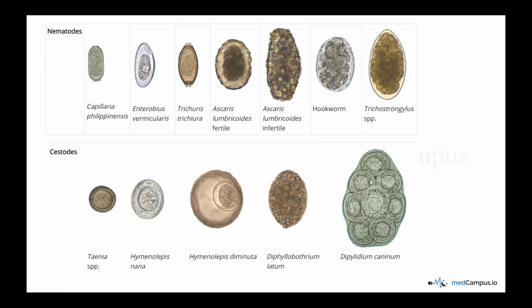And you might confuse this egg with the hookworm egg in the exam. Please, this operculum or lid structure helps you in differentiating it, and also the color. Hookworm is colorless, Diphyllobothrium latum is colorful. This is confusing, just look at this. And you might also confuse it with Ascaris because both are colorful. But you can see this single cell is getting separated from the surrounding here, and there's no operculum again. So that's the reason I'm telling you Diphyllobothrium latum can be differentiated from these close species, Ascaris and hookworm, with the help of the operculum which is present.